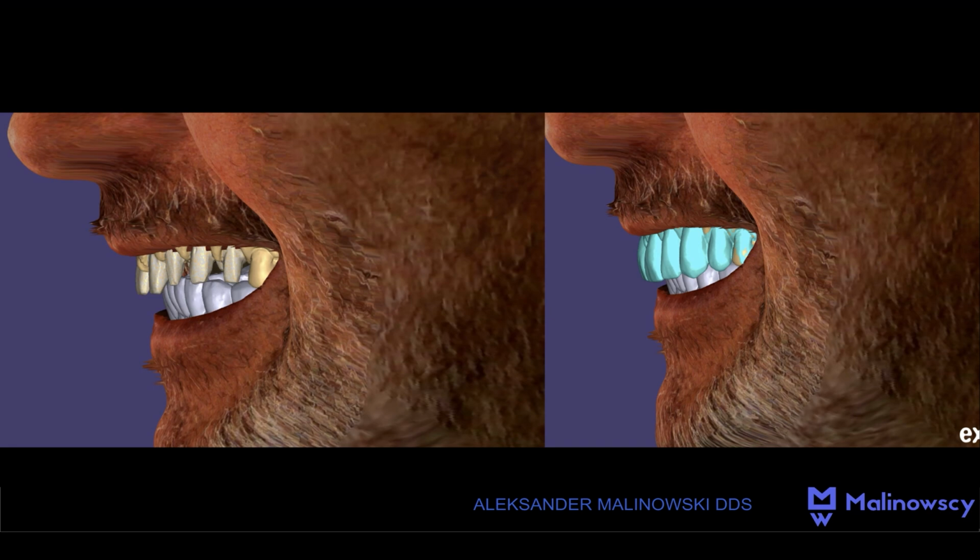Excessive preparation, on the other hand, can lead to pulp necrosis. For this reason, it is valuable to carefully plan the extent of preparation and the shape of the work even before starting the treatment. Tomography can also be used to assess the extent, shape, and degree of obliteration of the tooth chamber. And we can overlay this on the project.